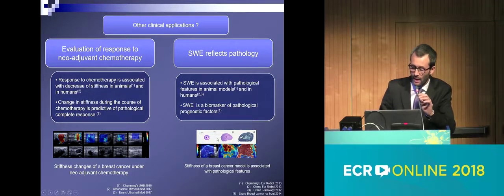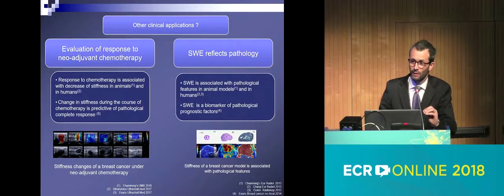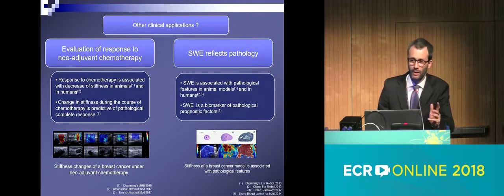Others also showed that shear wave elastography could reflect the underlying pathology. It has been shown in animal model. It has been shown in human. And really, some others showed that elastography and stiffness was directly correlated to pathological prognostic factors of breast cancers. Anyways, it's still research. I don't think you can really change your management on the basis of these results.